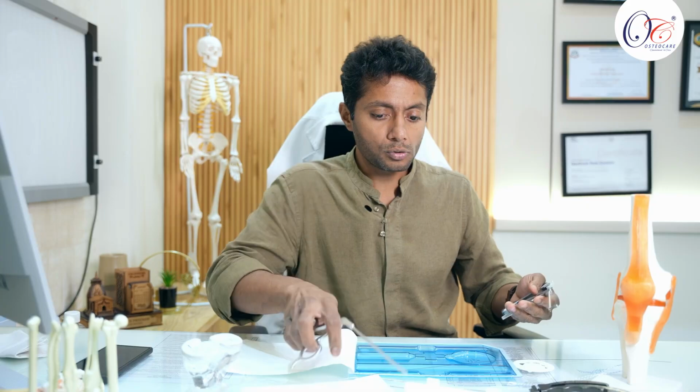Generally we use meniscus side specific jigs, which are called meniscal root jigs. These are used to drill the tunnel exactly at the location where we want, that is the meniscal root footprint. There are other instruments available with OsteoCare as well that come very handy when we do the root repair. And this is called the Python Mini, which is a direct suture passer.